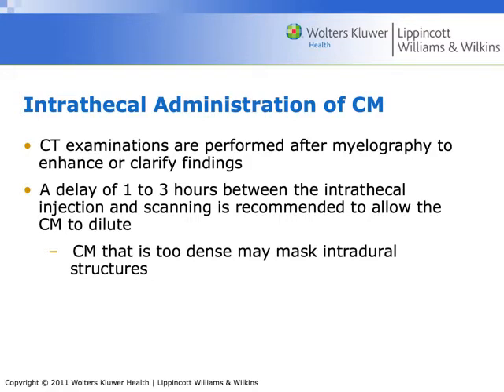So, intrathecal contrast administration. CT exams are performed after, that's it, myelogram. That's what I was trying to think of. Sorry, just talking too fast. So we're going to use a myelogram to enhance and clarify findings. So we want a delay of maybe an hour to 3 hours.